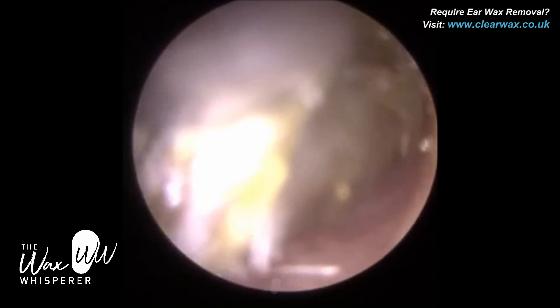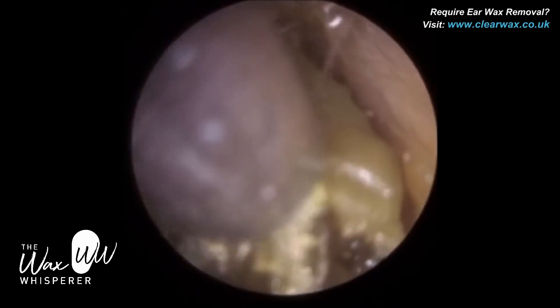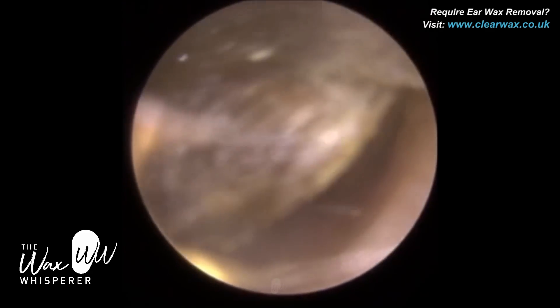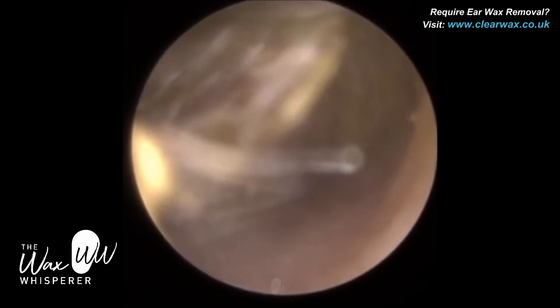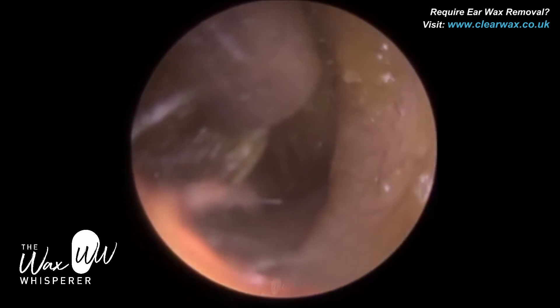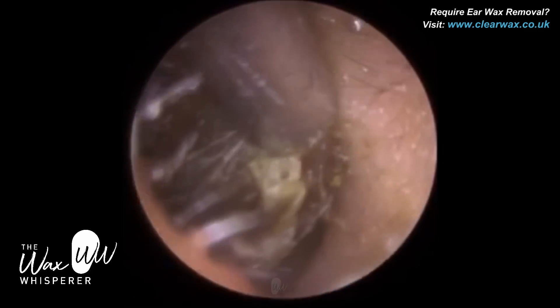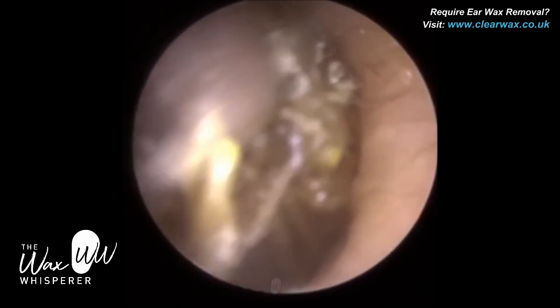There's some keratin here and a bit more lateral wax. The wax I'm trying to extract at the moment was a bit softer and more glutinous, whereas the more medial wax — which you'll see a bit later — was firmer, harder, and darker. We're at the first bend of the ear canal as I'm trying to wriggle this out, having to manipulate the wax around the bend. I'm bringing it to the right — you can just see the entrance of the ear canal to the left there, the cartilage, and the ear canal goes to the left and then right again. I'm wriggling it around the first bend, slowly suctioning and bringing it forward.